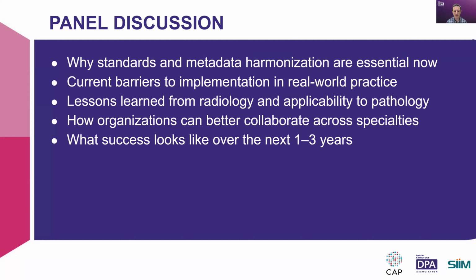Across the enterprise outside of radiology, another lesson we've learned is that it's a standard, but how different specialties or even different vendors choose to implement the standard is variable. A good example of that is in ophthalmology. In ophthalmology imaging, a lot of the machines are all-in-ones. They provide the camera, the storage, the information system, all there.